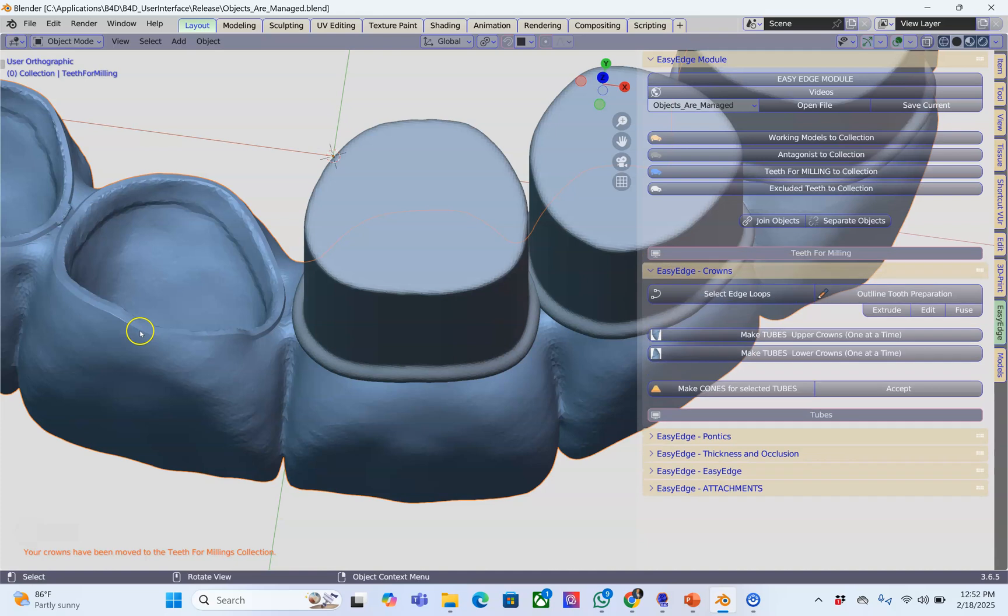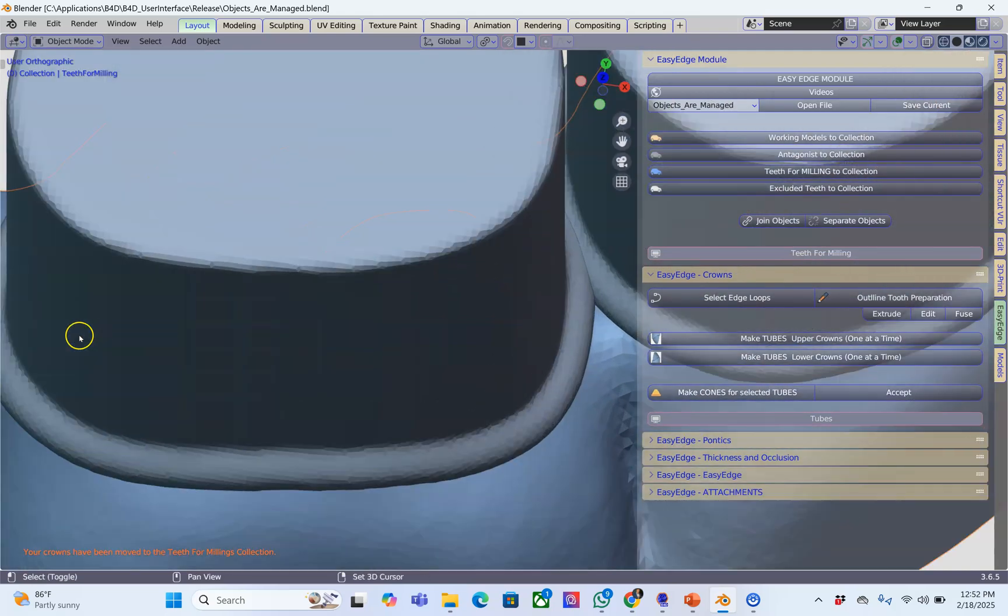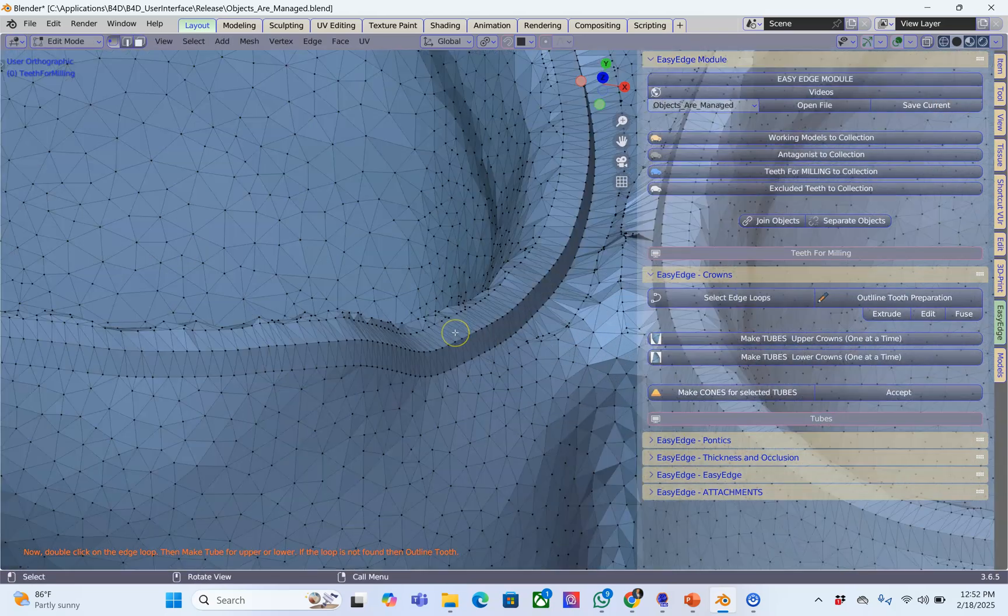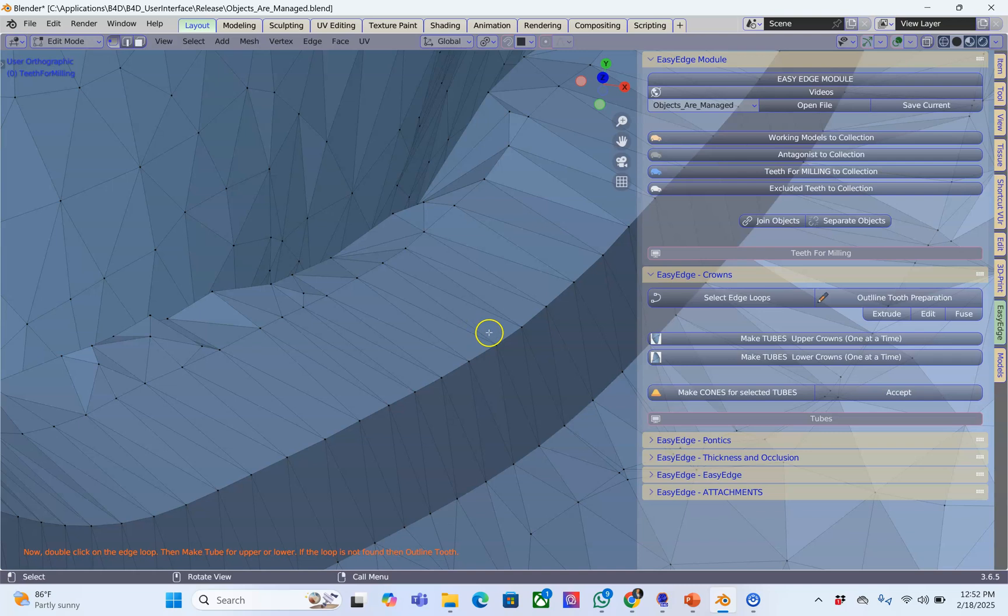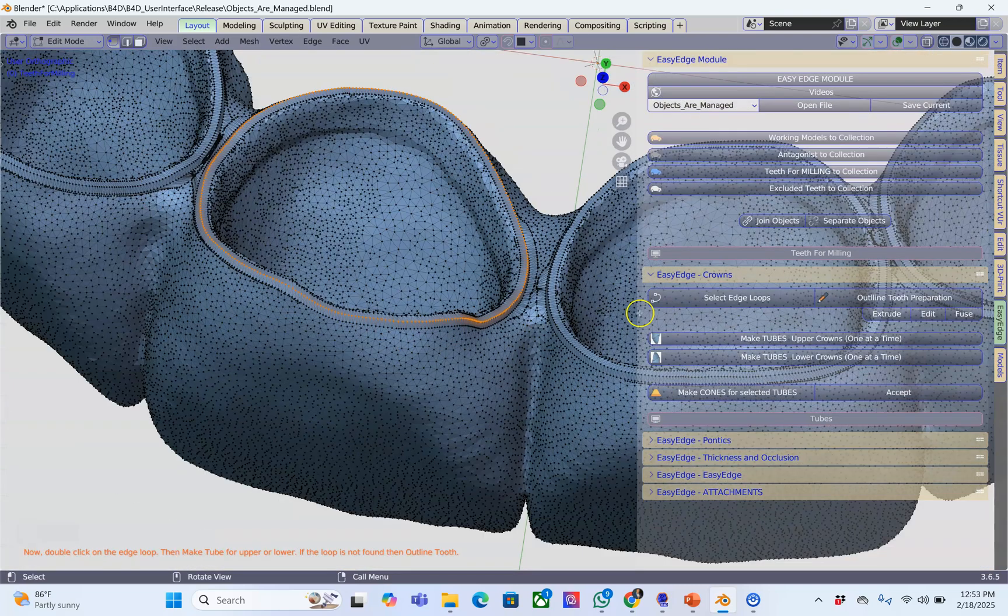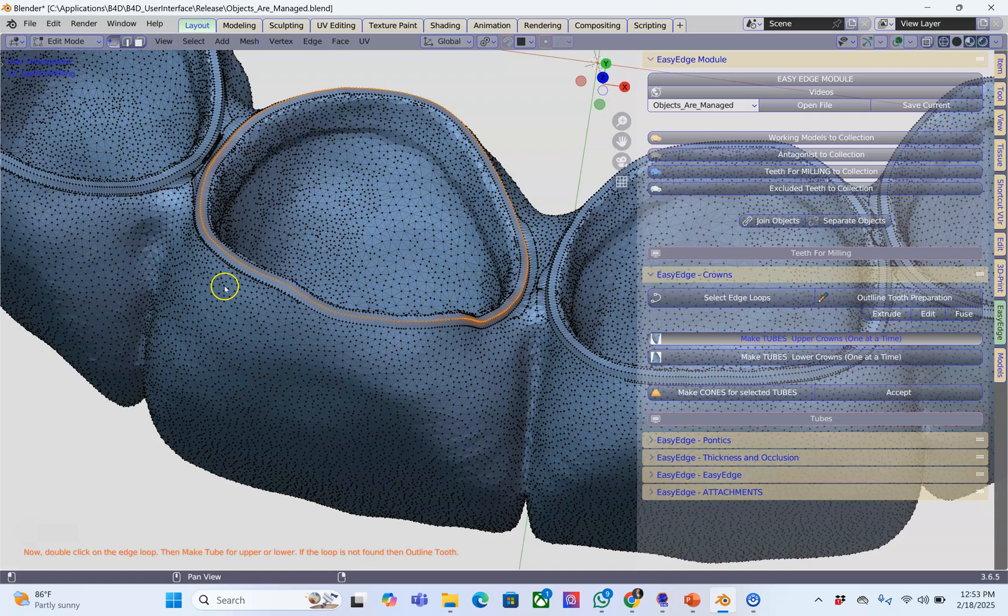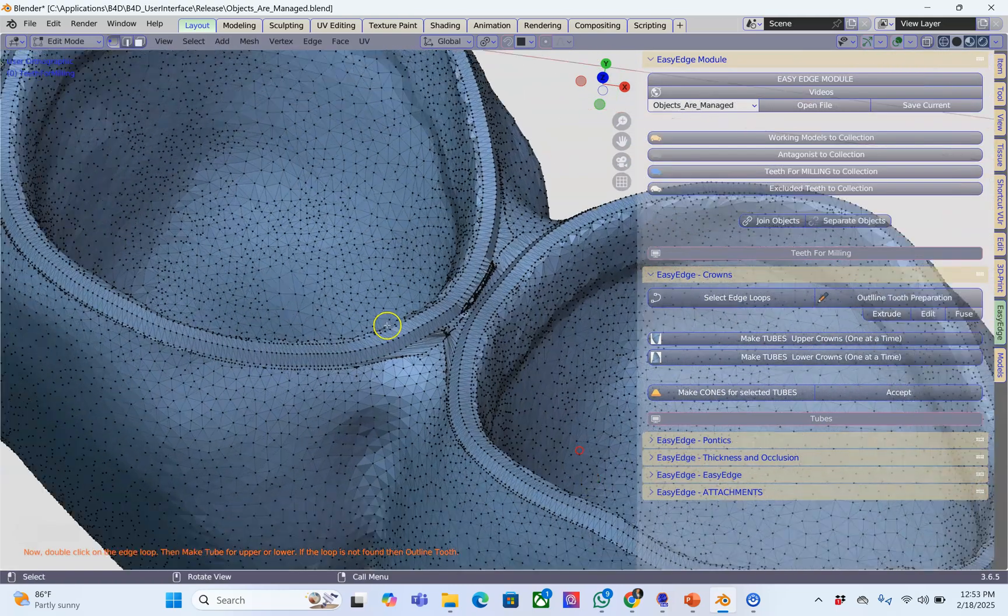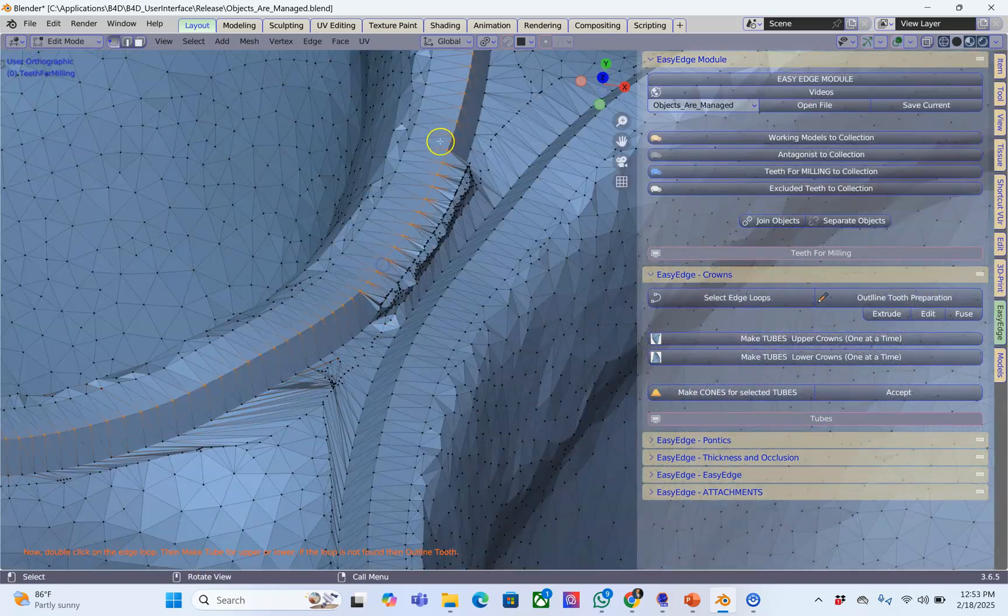I think this bridge would do the job. Select it, edge loop, zoom in, double click on that edge and then make a tube. I'm going to hit the fast forward button.